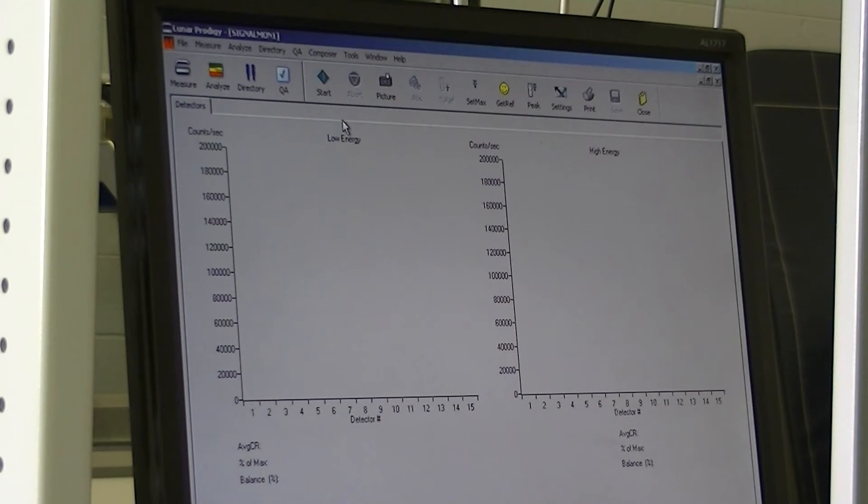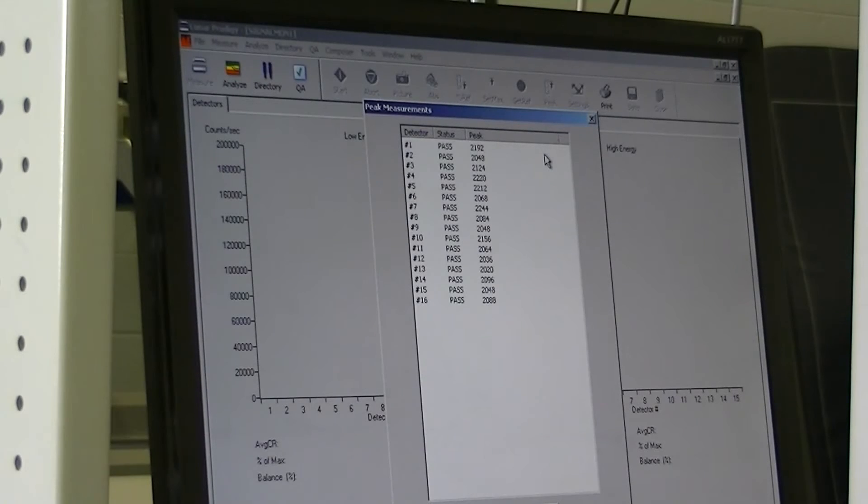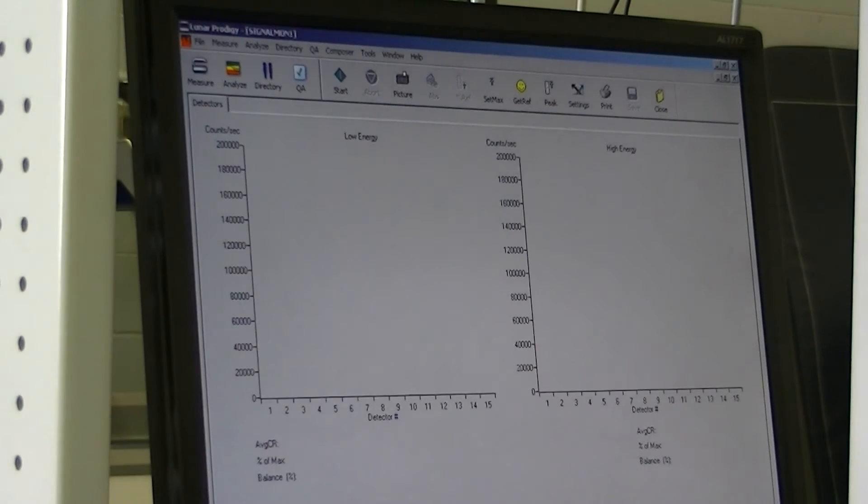Then from here, we're going to put our peaking brass over the slot on the collimator to block the x-ray. Once the peaking brass is over the slot on the collimator, go to your top toolbar and select Peak. This will run through a series of tests to test the detector. Once peak has passed, you'll get a printout of peak measurements of all passing. Hit OK and that'll secure the numbers in.